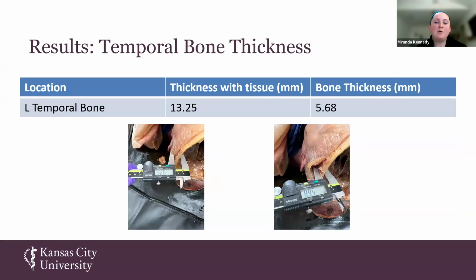Additionally, I measured the left temporal region thickness with skin and tissue as well as without. The purpose of this was to confirm recommended needle length with previous studies.